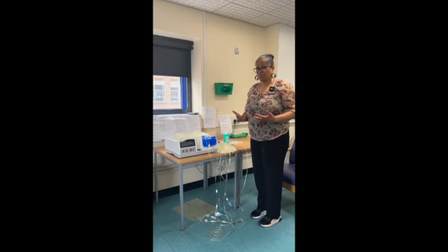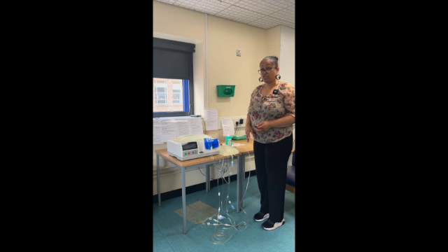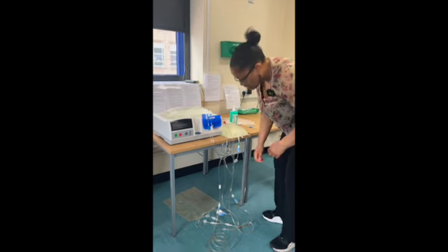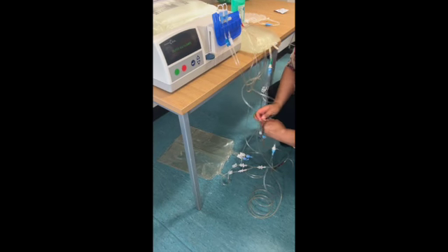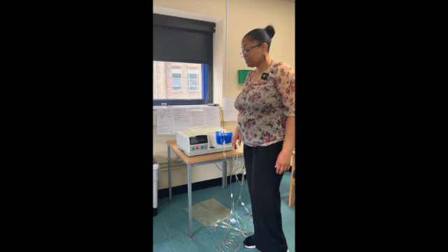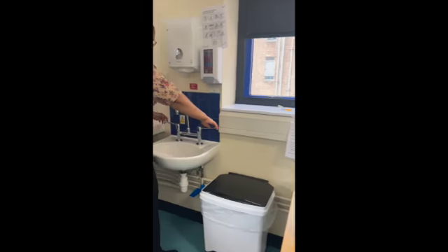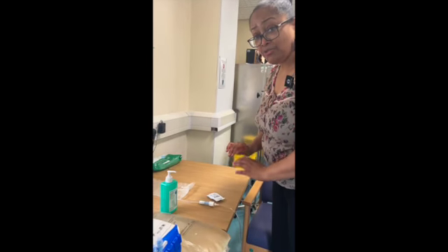So imagine this is the next morning and the therapy has finished. What I need to do is close the twist clamp and all the other clamps. I'm now going to press the green button and then wash my hands for 2 minutes. So now I'm going to put a new cap onto the catheter. So I've got to be careful when I open this again to avoid contamination.